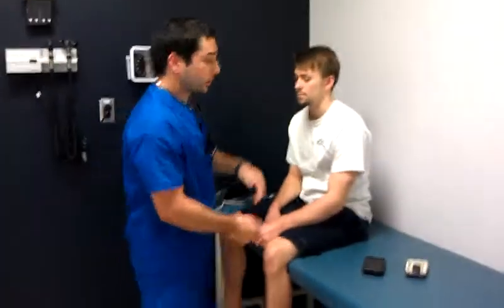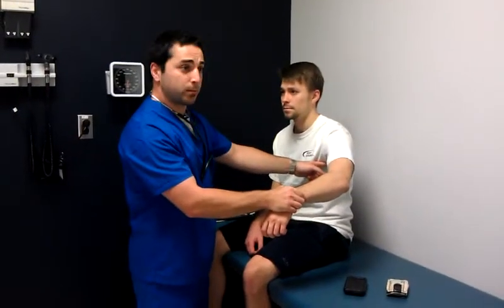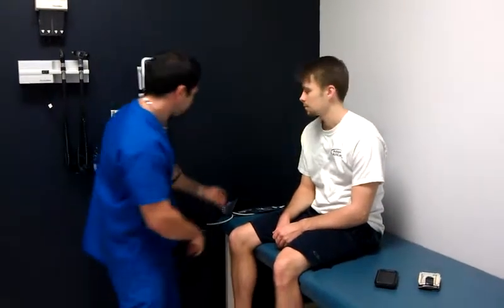Also, it's important when assessing the patient's temperature through the axillary region by placing the thermometer in the armpit. He clenches down. Also, it's taken through the rectal opening while the patient's in the Sims position. Next, I'm going to be assessing you for your blood pressure. So we find out his auscultatory gap.